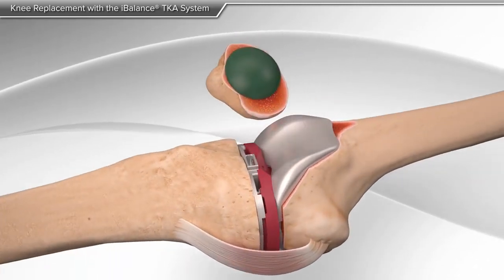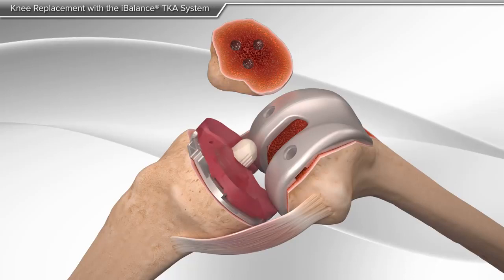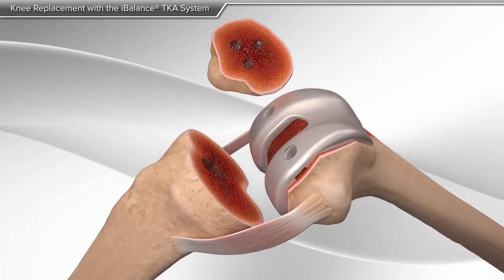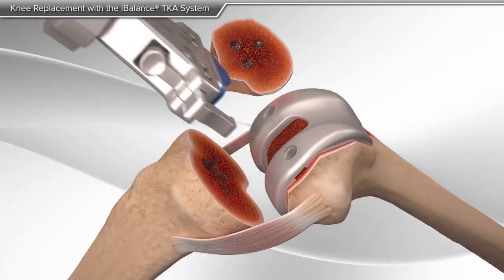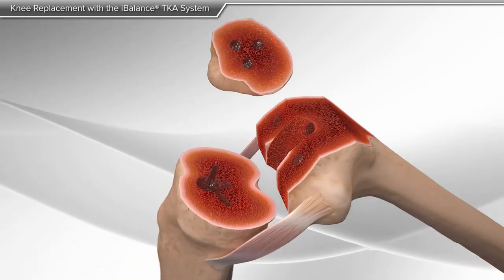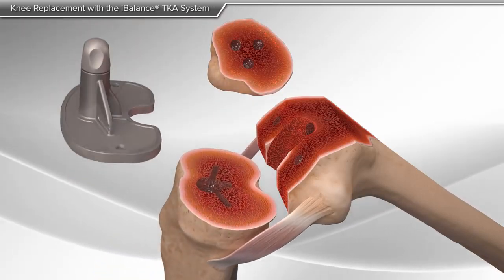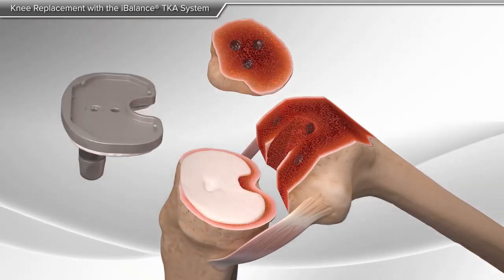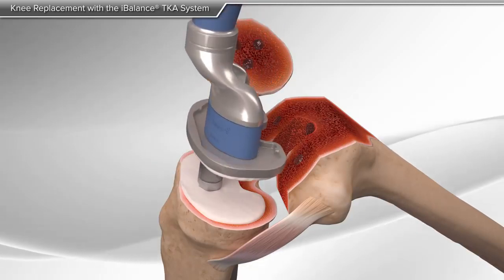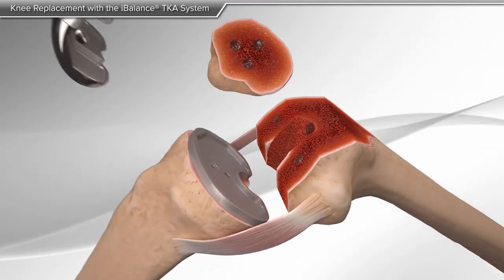The trial implants are then removed, and the surfaces are prepared for placement of the final implants. Your doctor applies bone cement on the backs of the tibia, femur, and patella implants for final fixation.